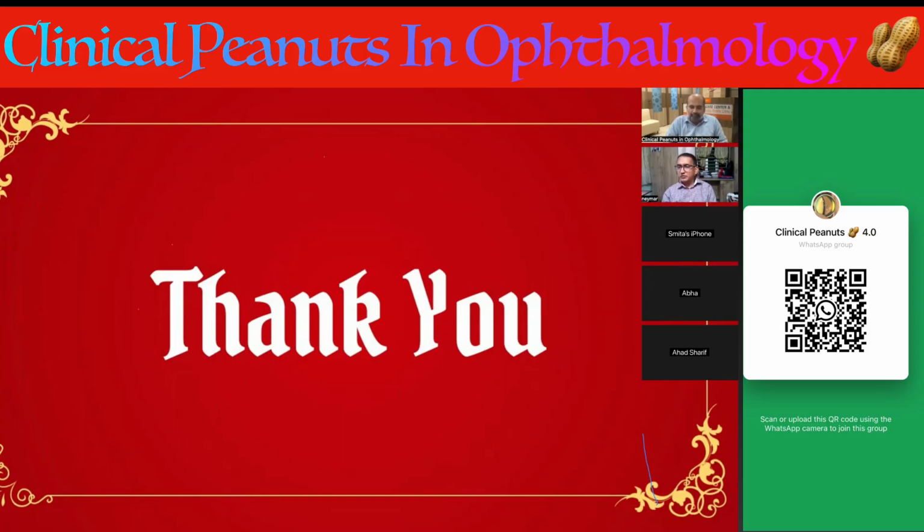You should not have trouble with something else. You should not be caught with the rexis, and you are planning for toric and you are having trouble doing some very hypermature cataract where a runaway rexis is there. Then your confidence level will go down. It's better to select for the initial 5-10 good cases in which you feel comfortable, and then go ahead with the difficult ones.